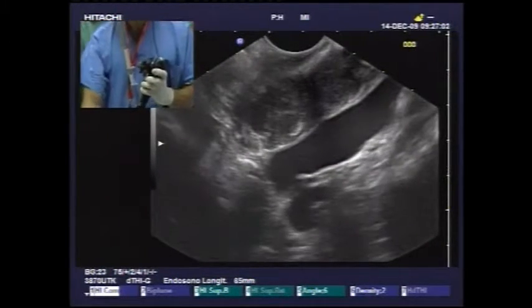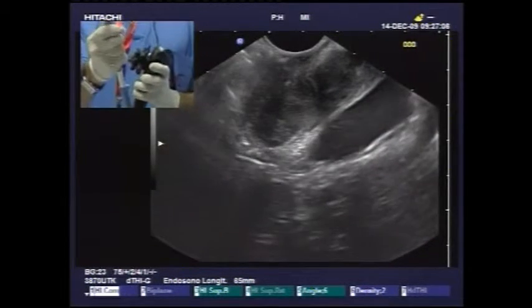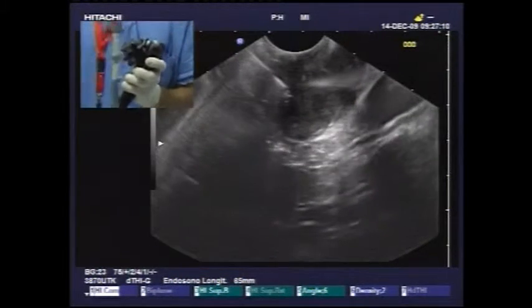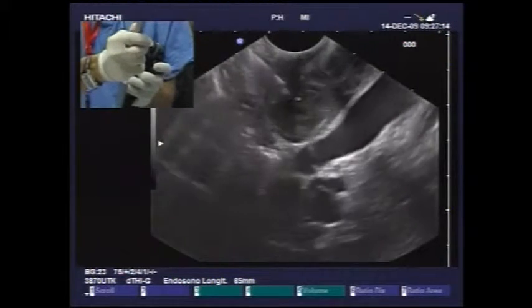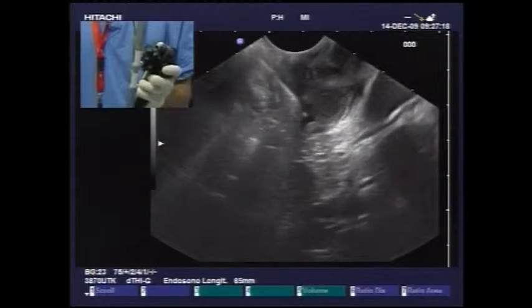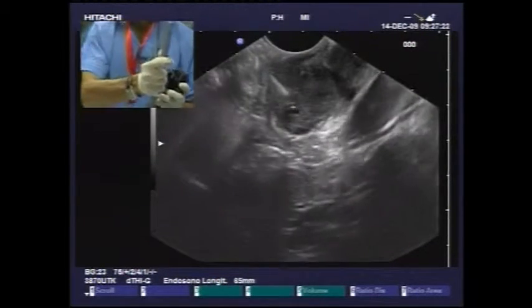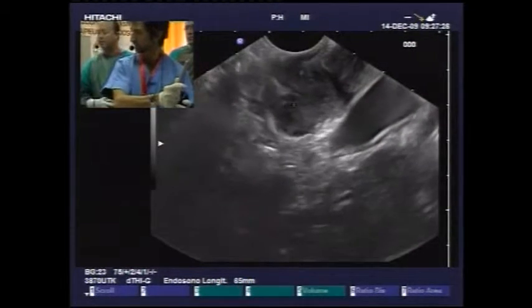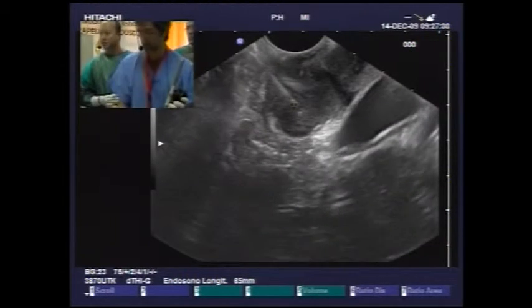Can you please hold this? No, don't worry, she's great, I think. Okay, you see the needle tip here. Yes, we can. It's a fairly hard node, yeah. And here's the tip. You can see the movement there. It tips right in just lateral to the center of the lymph node. We can go back and do. Okay, that's now better.